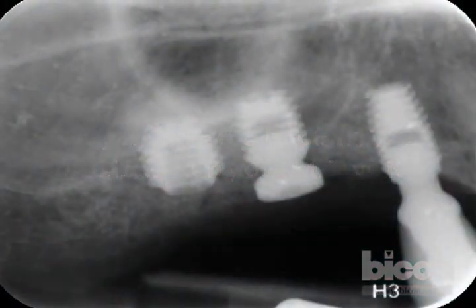Yes, you can. It will cost you either the implant or the window opening. The best way to prevent that is to use the inserter retriever. That way, if you go in too deep, you retrieve it. Or put the sinus lift abutment in early on so that you don't go in too deep.